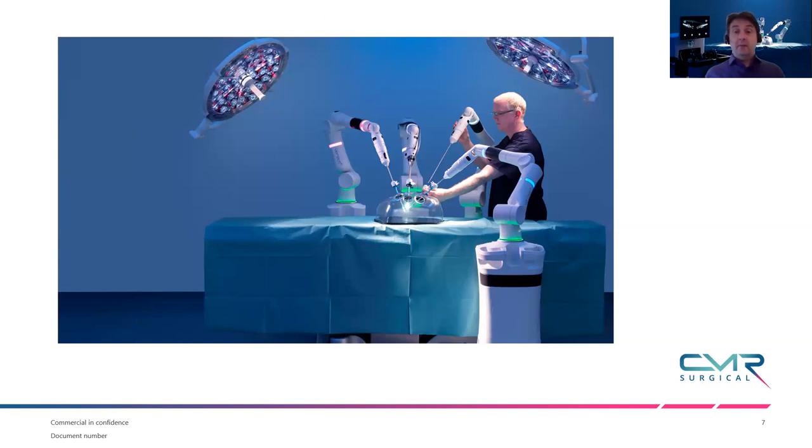The other thing we can say about this system is that once the instrument is locked and is in position, it is possible to move the shoulder joint, move part of the joints to the side to create space at one side of the operating table for the assistant. So this is a small footprint on the OR floor, but also has maneuverability and stability that we can move the arms so that we can get assistance in safely in between the instruments to help and assist as a bedside assistant.